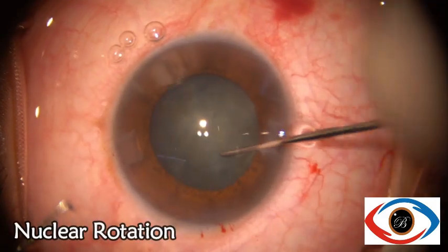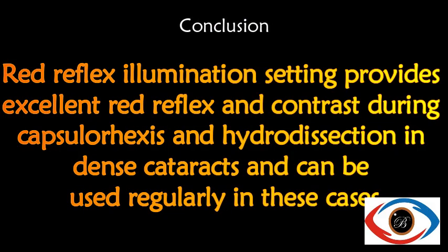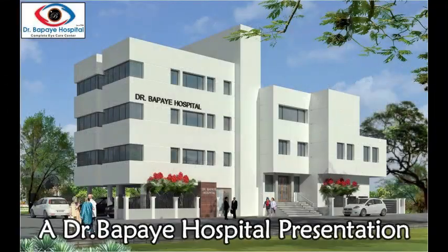In conclusion, the red reflex illumination setting provides excellent red reflex and contrast during capsulorexis and hydrodissection in dense cataracts.